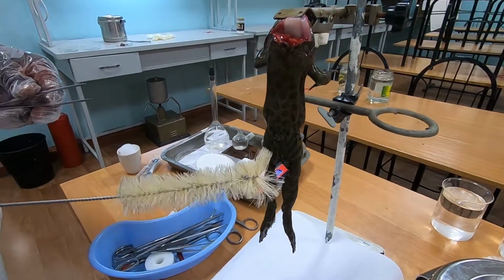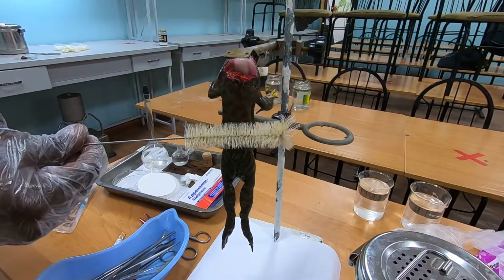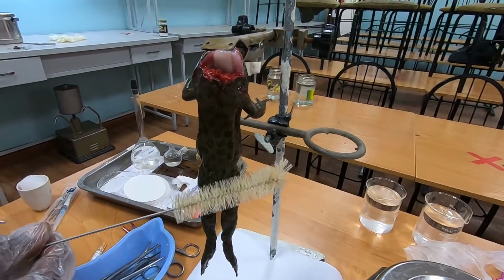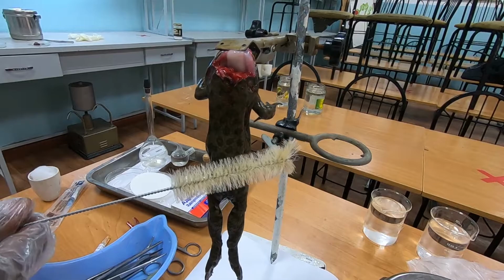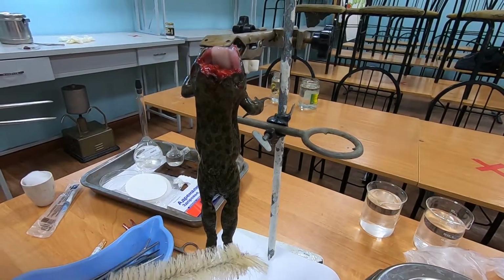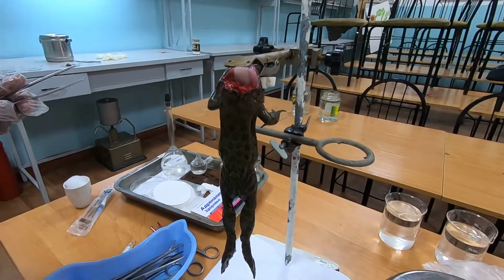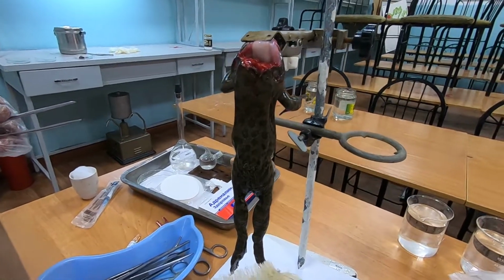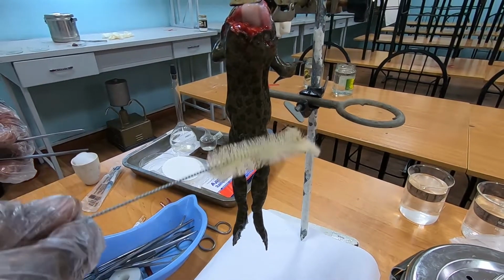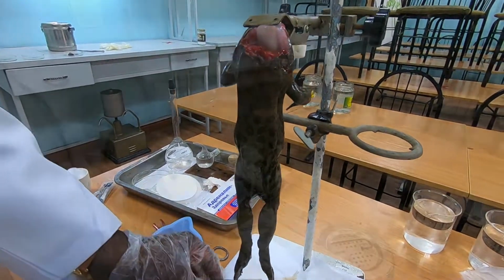Now it's winter. The frogs are very weak, all right? So they don't react quickly. So this is just to show you how frogs, or even our human body, reacts to any touch, any feeling. If you touch your fellow human beings, you see the person reacts. Okay, I think after the first one, we'll leave it for some few minutes.